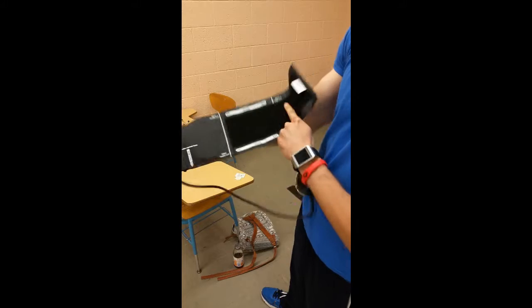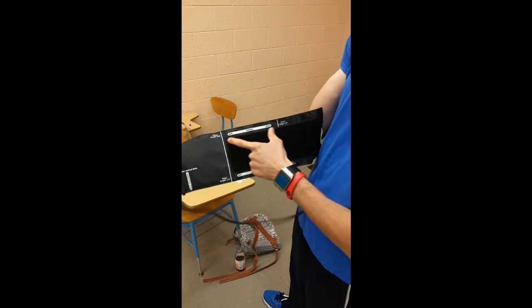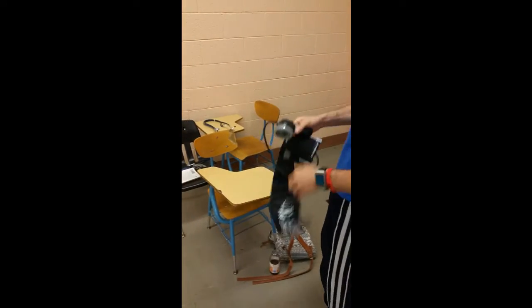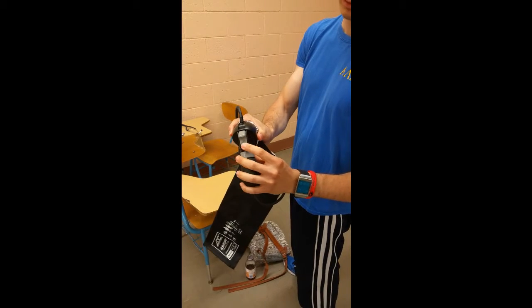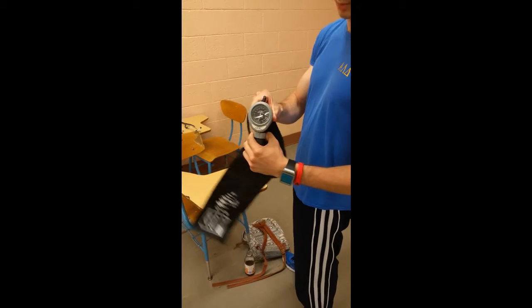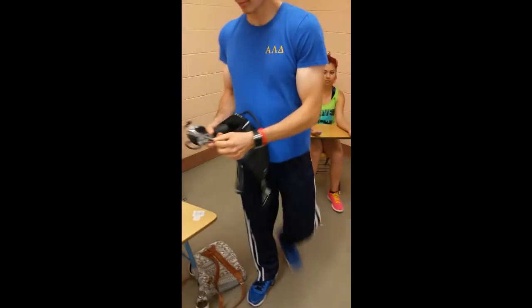Next, locate the brachial artery line on the cuff as well as the range where the subject's arm should be placed. For this demonstration, a switch release will be used, but keep in mind that knob releases are common as well. What you want to do next is grab your stethoscope and make sure that it is working properly.